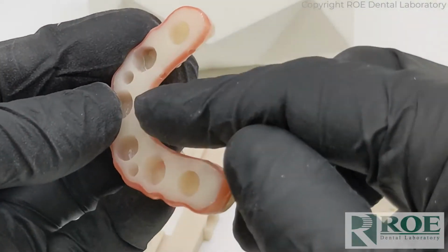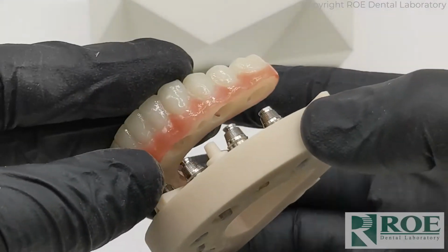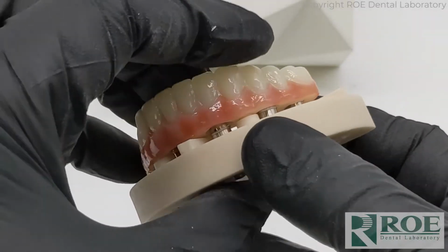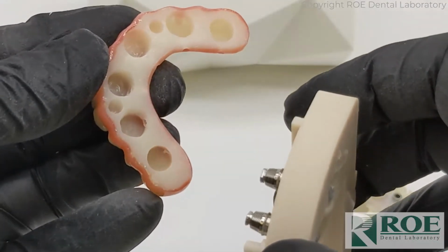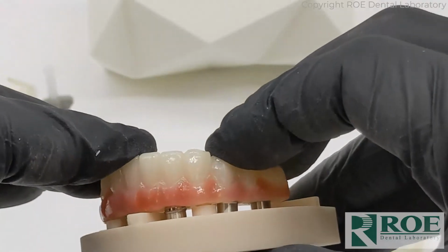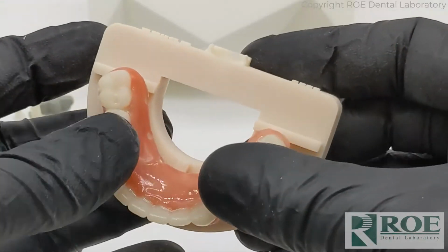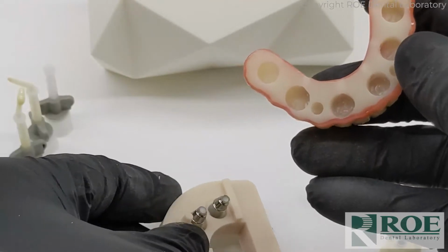One on each site, drill, so there's 6 ports. And then instead of just opening up the one site that we noticed was holding it up a bit, I went ahead and adjusted, opening up a little bit of these 4 sites, just to make sure we had a little bit of passivity, to make sure it's seated all the way, right? So you can see it's down, just like the RAPID Appliance was. And we'll move on to picking it up.